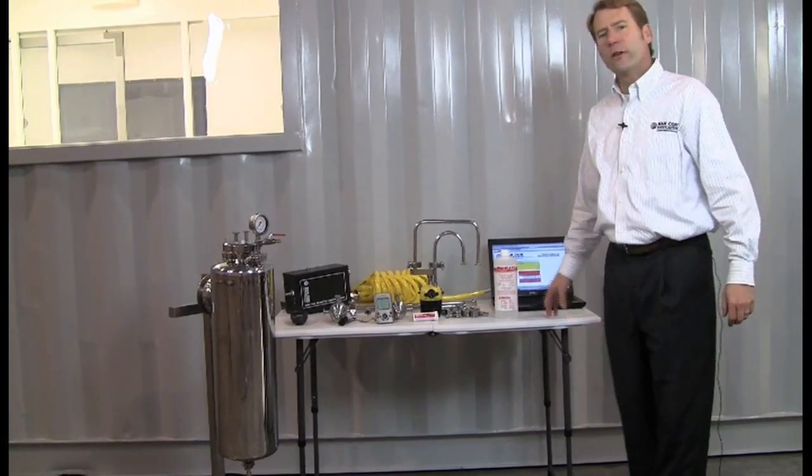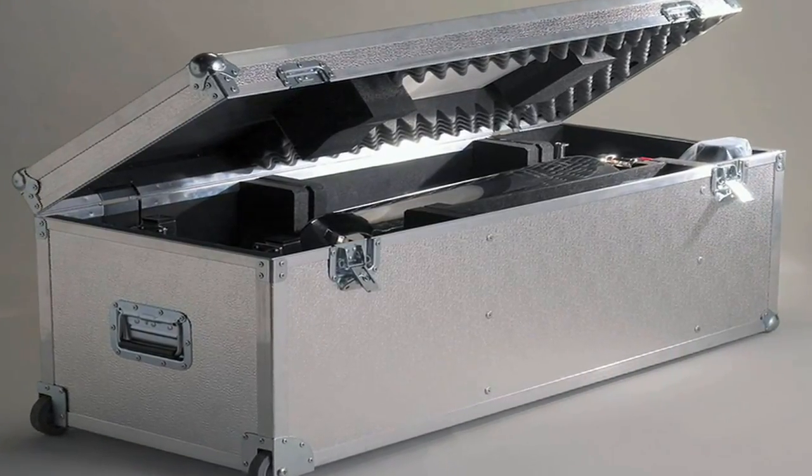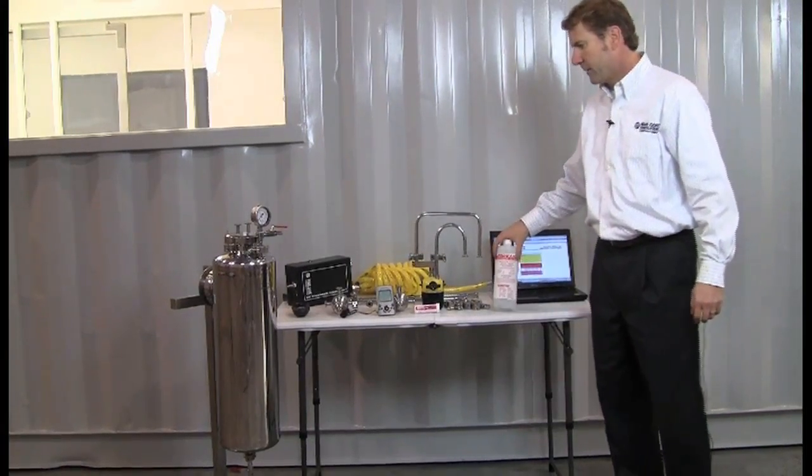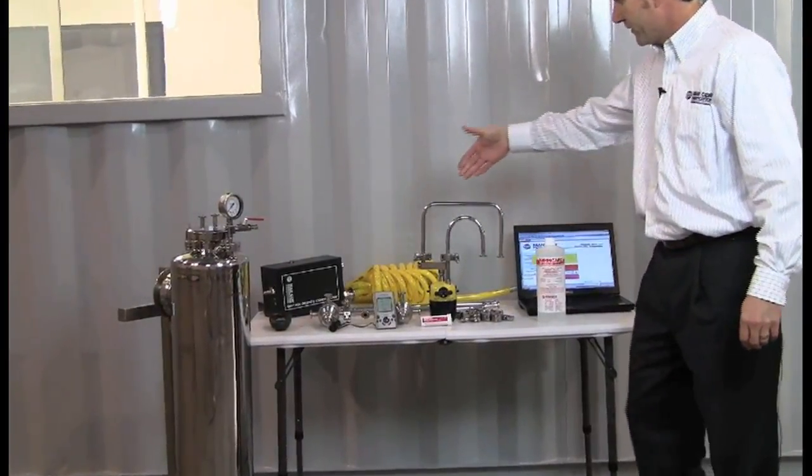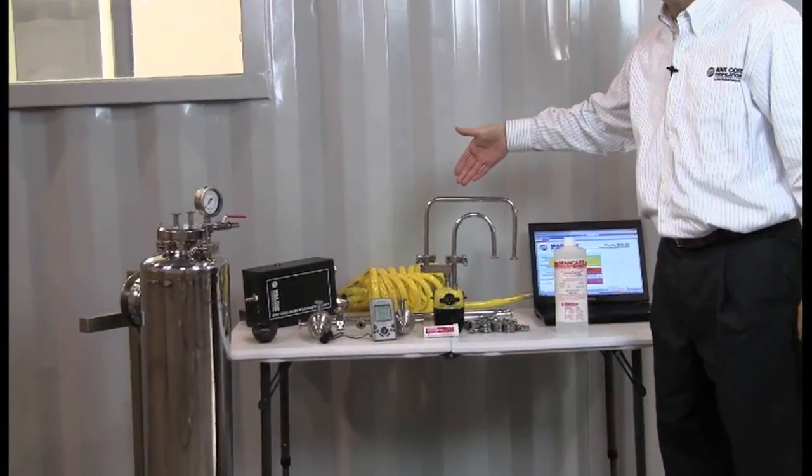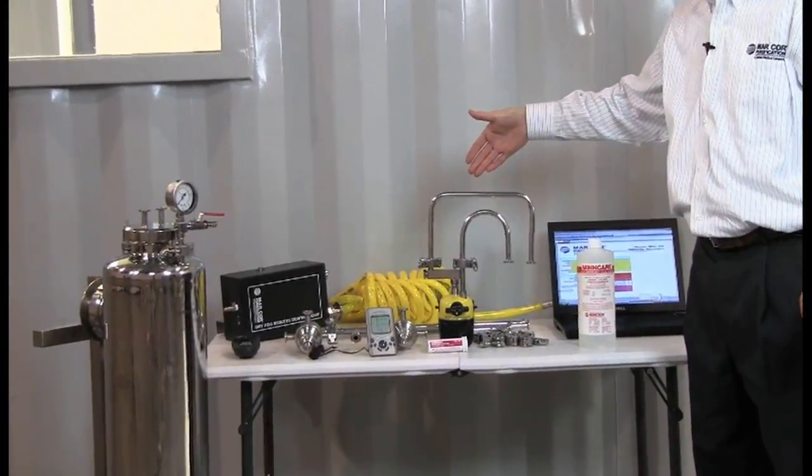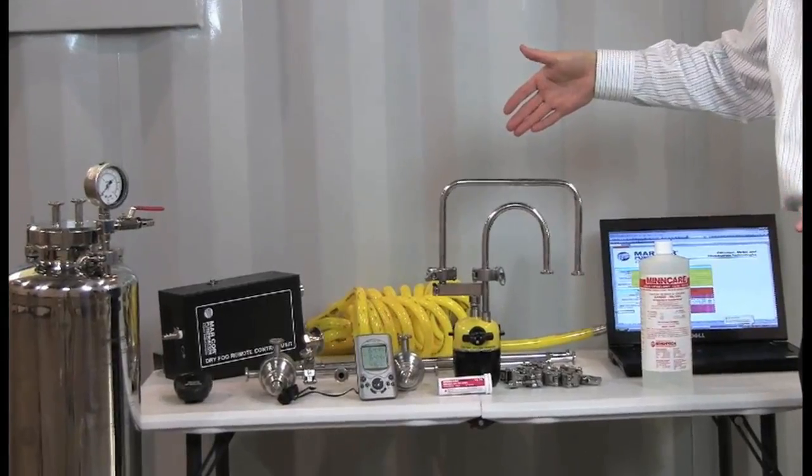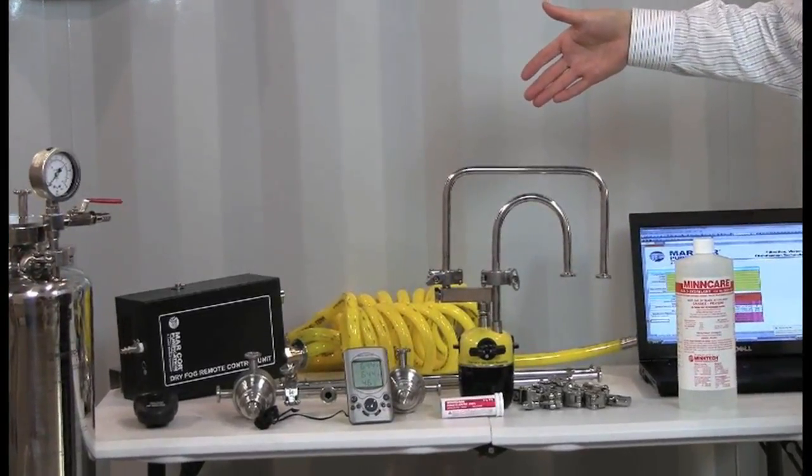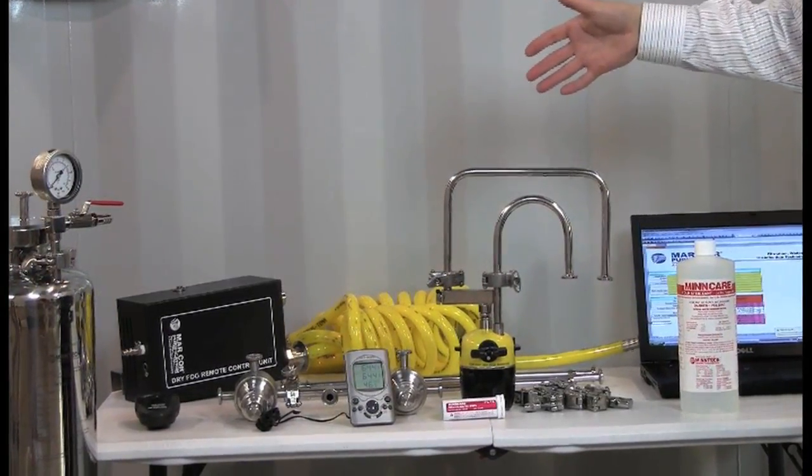These are the components to the Mar Cor dry fog system. Mar Cor dry fog system utilizes Minncare that goes in the tank. This is the head, which is actually the heart of the unit that puts out the 7.5 micron droplet and gives you the ability to disinfect 35,000 cubic feet of clean room at one time.